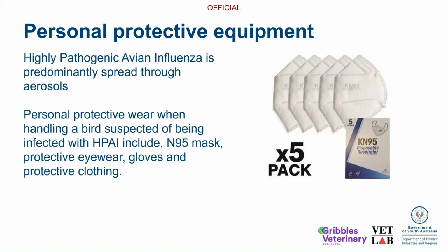appropriate PPE. As you're all aware, and I certainly don't need to go into this in detail, the main spread as a zoonotic agent for HPAI is through aerosol spread. So use an appropriate N95 mask, protective eyewear, gloves and protective clothing prior to handling and sampling birds. Obviously, this also includes necropsy of the bird, and we'll come to that at the end of the presentation.